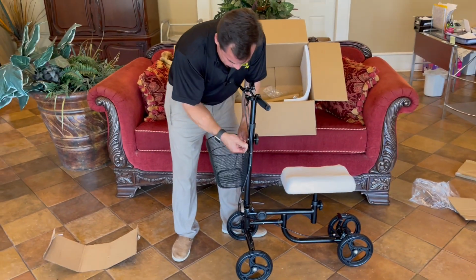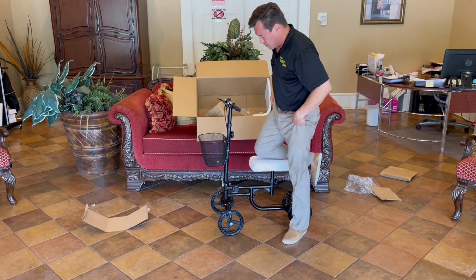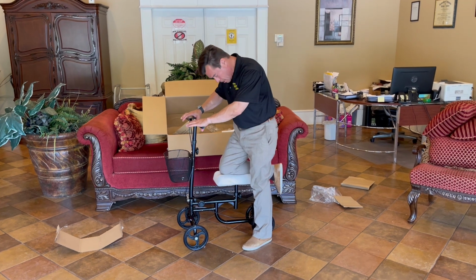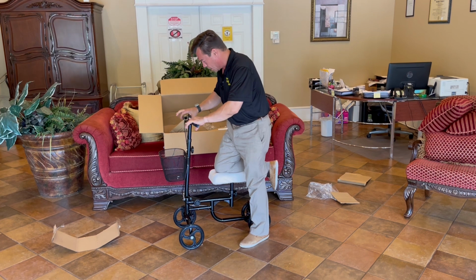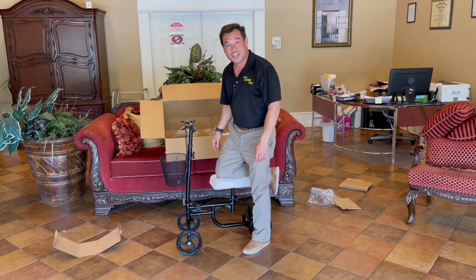Okay, now we always send that with them. This is actually a little bit high for me, but I want my foot to be flat on the floor so I can drive it forward. Check to make sure we lock on both sides. We do. And your knee scooter's ready to go.